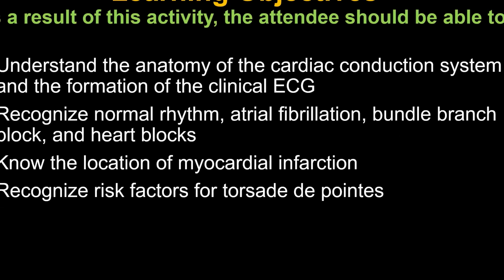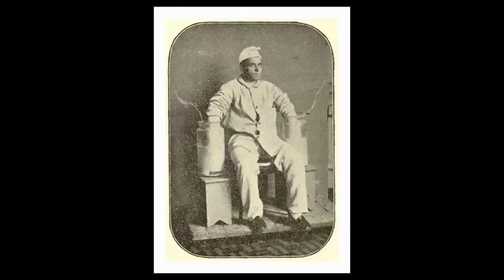To know the location of myocardial infarction, and to recognize some risk factors for at least one of the serious ventricular arrhythmias.